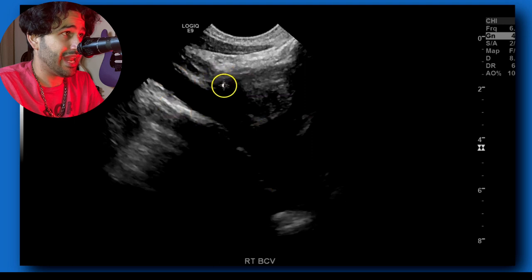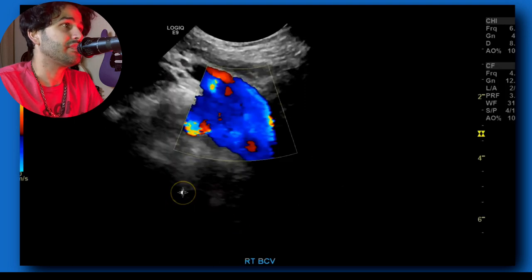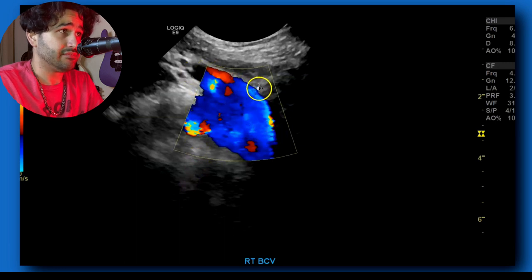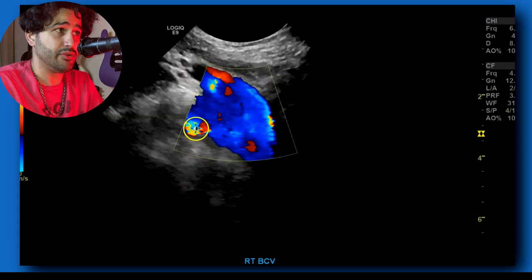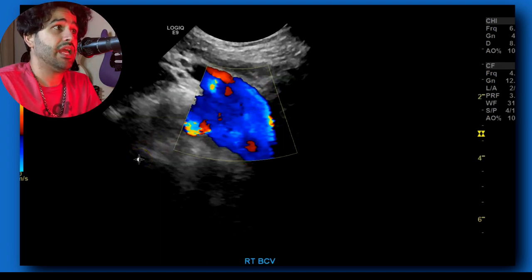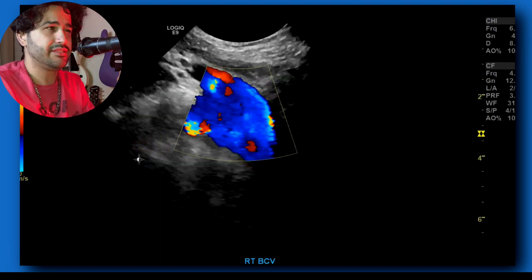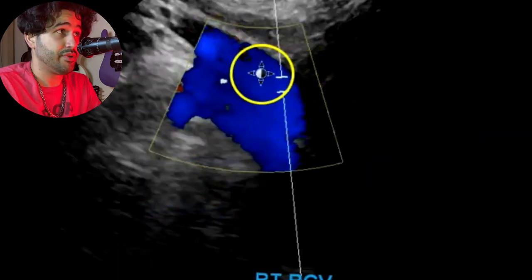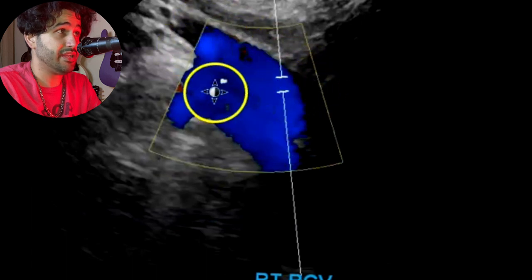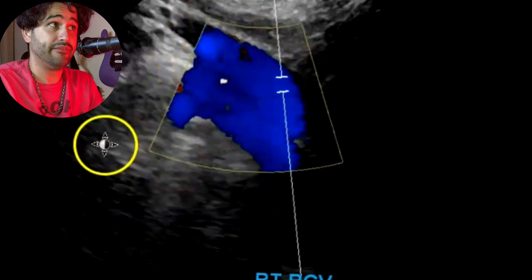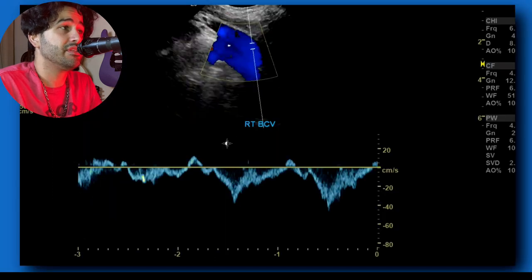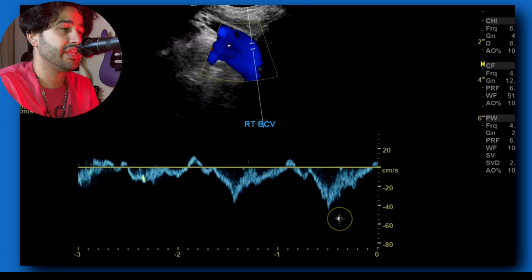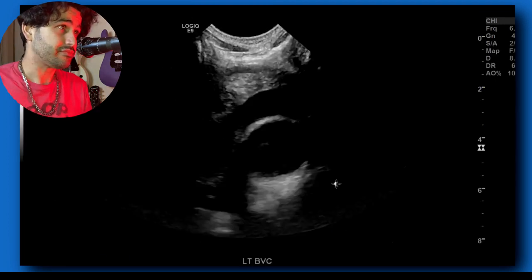Right BCV — again you can see the clavicle shadow. Put the color doppler. Here's your vein, this is one part of the vein, that's the other part — all this is mirror image artifact. You can try to adjust the scale and gain but it's still going to be there. You can see the outer limits of the vein and then what looks like a duplicate vessel. Take a grayscale image, color doppler, and then spectral doppler. Make sure the gain is not too high and the scale is not too high or too low.